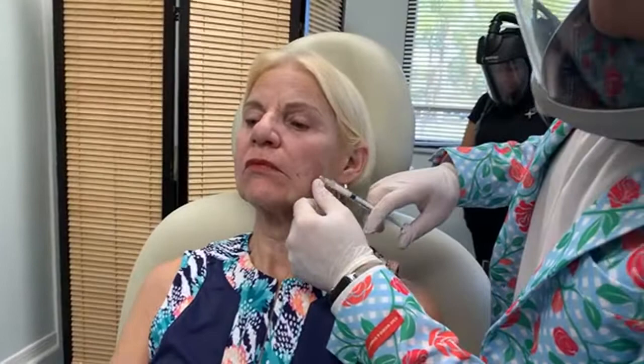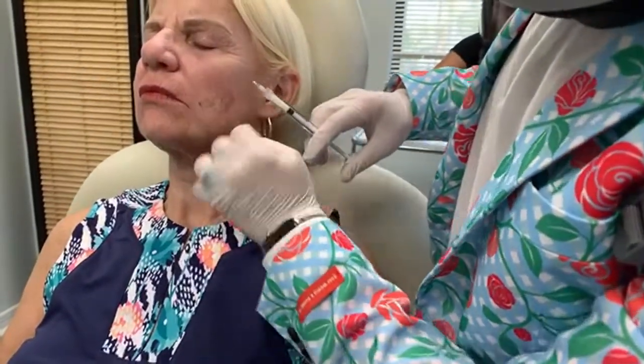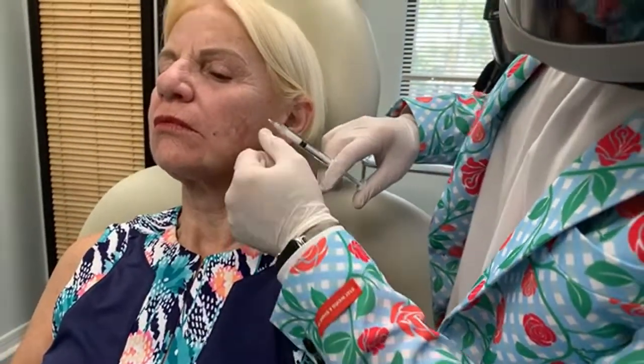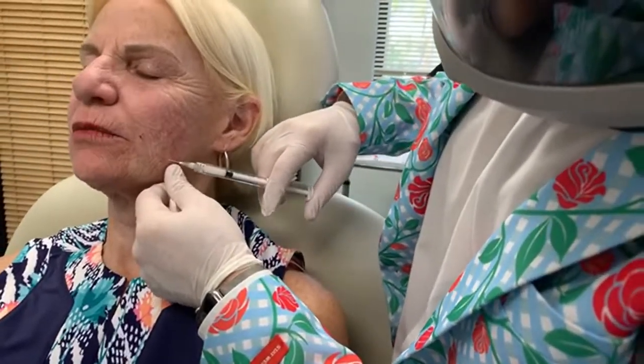That's fine. If you could combine all of that into this one, please, for me. Into the 3cc syringe, thanks. So really a nice improvement. Make a big smile for me. Looks good. Now relax as best you can.